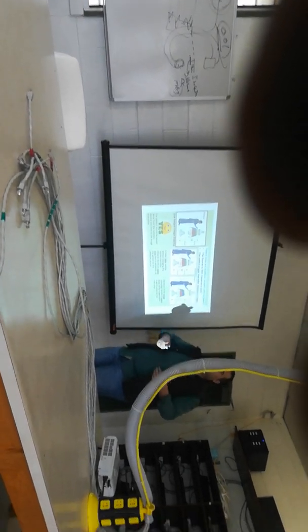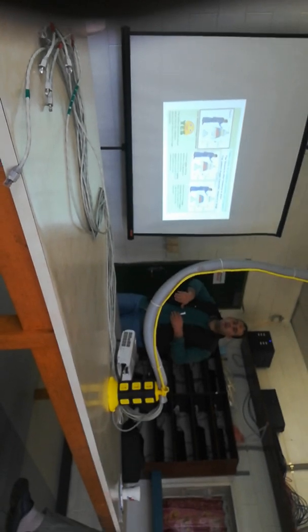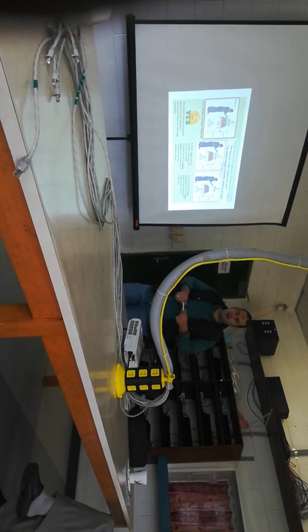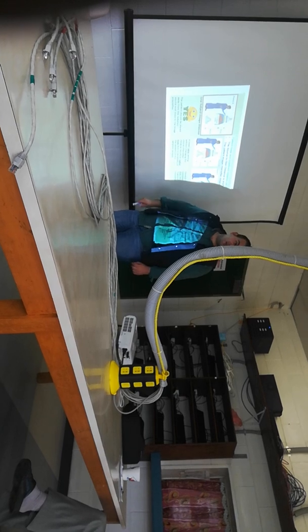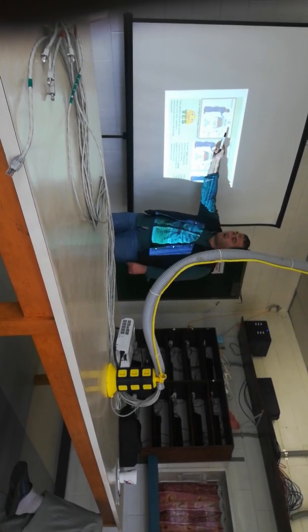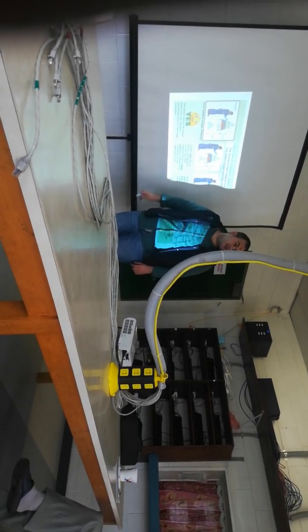Sometimes when operating in the operating theater or with fluoroscopy, what's the proper table position to protect myself? Here you will find that the distance from the X-ray tube to the patient is 80 centimeters, and the distance from the table to the image intensifier is 30 centimeters. We will find the dose is 1 dose unit.